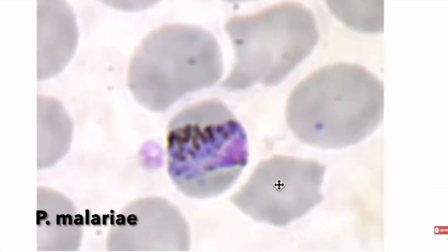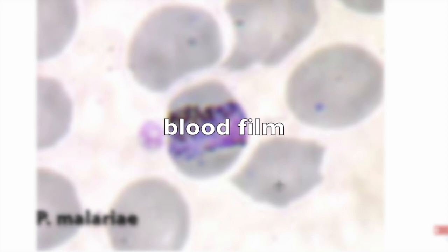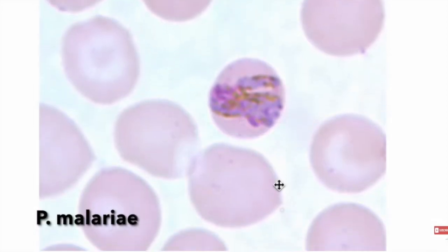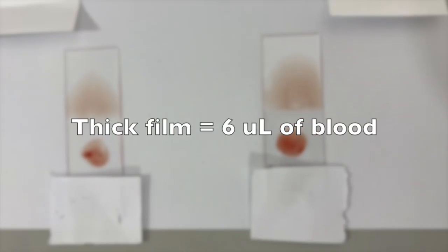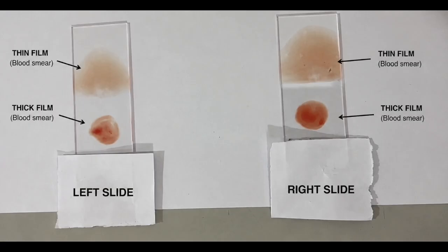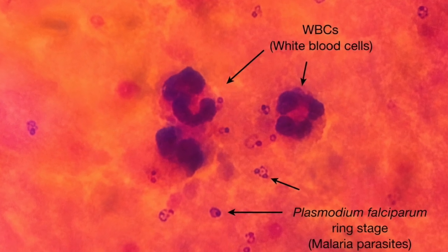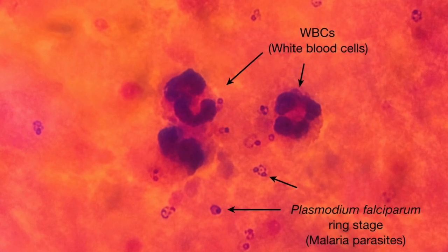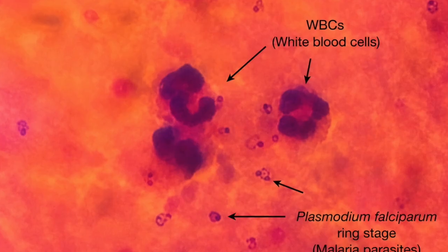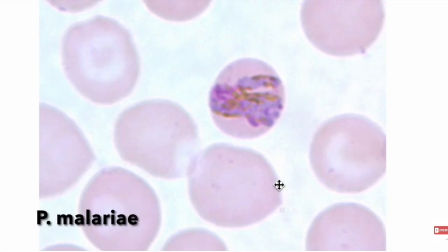First, how do you tell P. malariae from P. falciparum? If you're looking at a blood film, it is made either as a thick smear or a thin smear. The clinics like to look at both. A thick smear will show you if the parasite is there, it will burst the red cells and release them. So you see them as little granules, and if you have a look at this image, you see the rings of falciparum. But then a thin smear will let you really pay attention and see the different morphology and be able to distinguish between all the species that cause malaria.